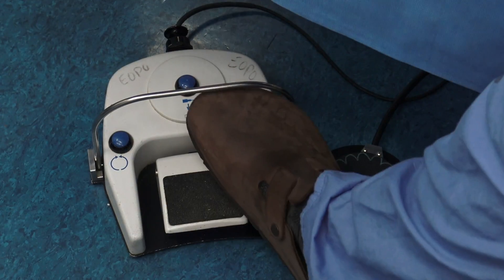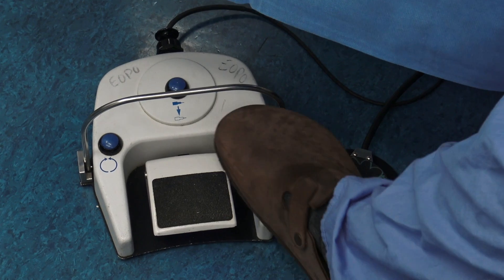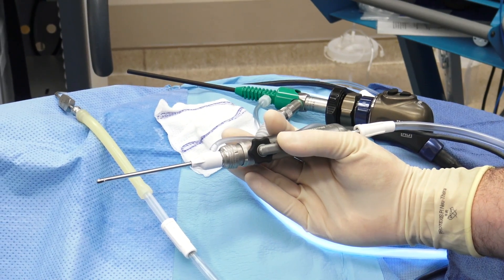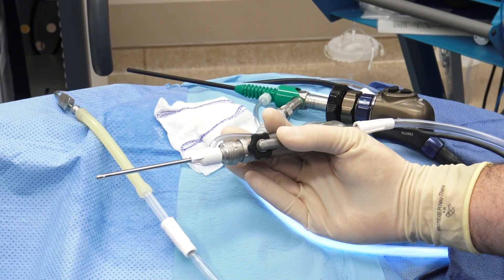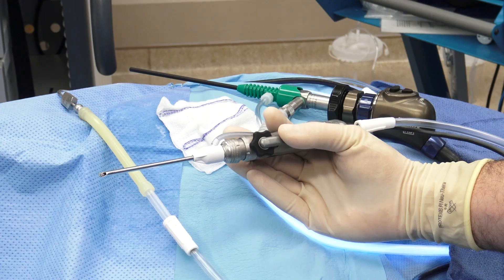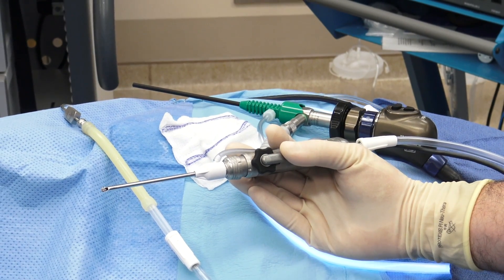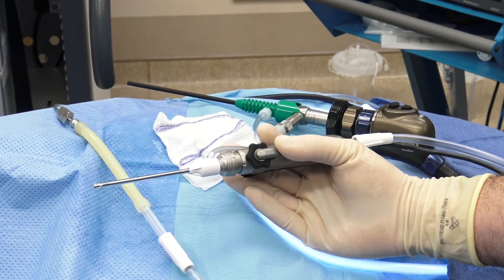With our buttons, we have a delta button that opens and closes this with about a quarter turn. I'll hit that delta button on the right side and you'll see this change about a quarter turn — partially open, fully closed, partially open, then fully open. So it simply oscillates or turns by quarter turns, allowing you to open and close as you go in and out of the nose.